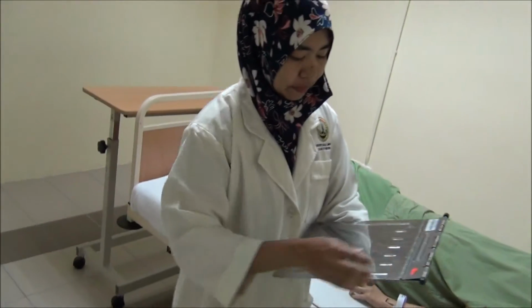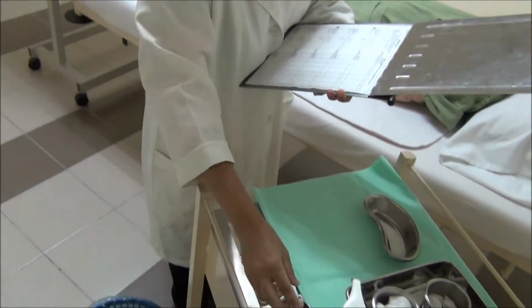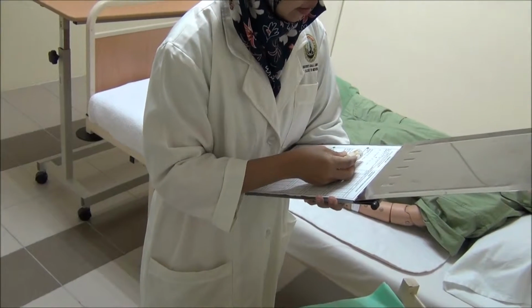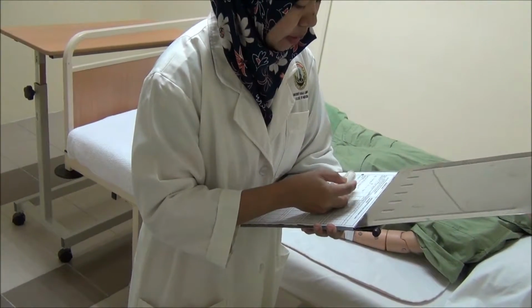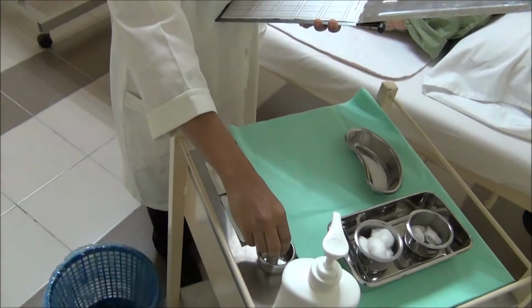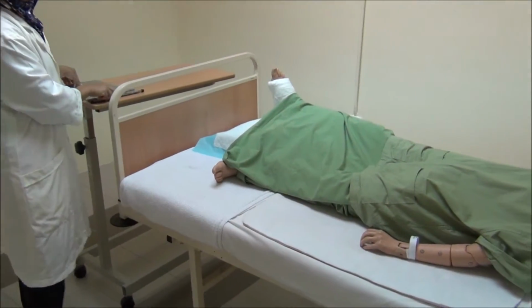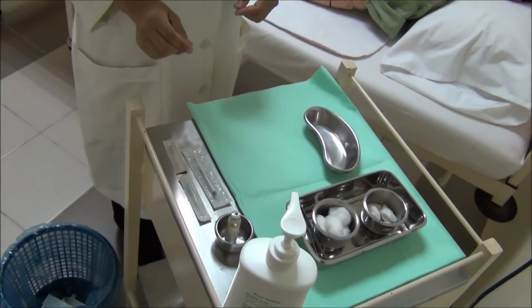Perform first check of the medication. Assume that she has performed hand hygiene. Check Actrapid 10 units TDS. Expiry date December 2020. So she has checked it's the right medication, and now she's ready to prepare the injection.